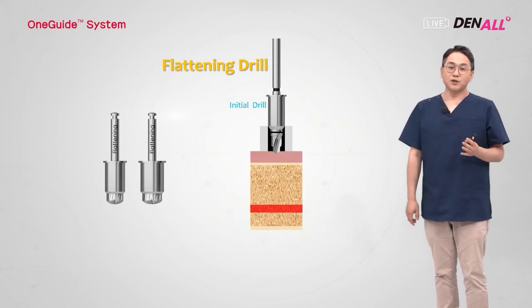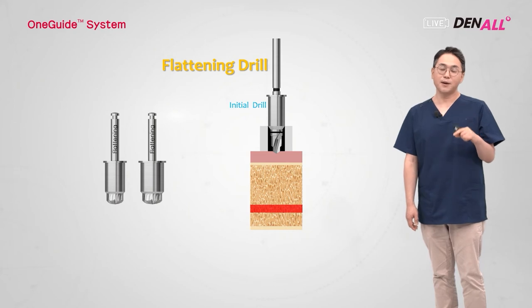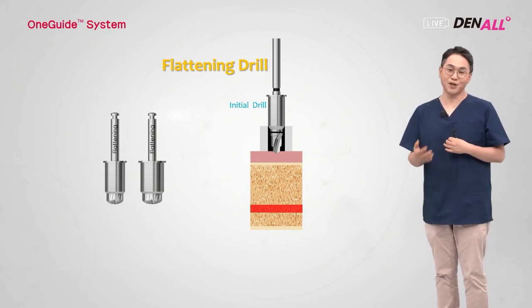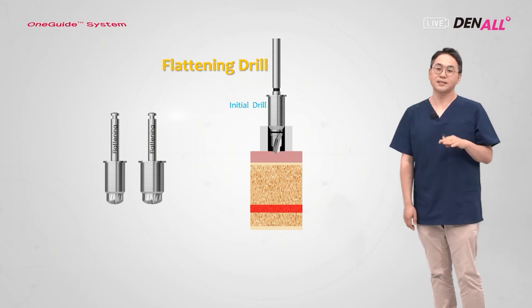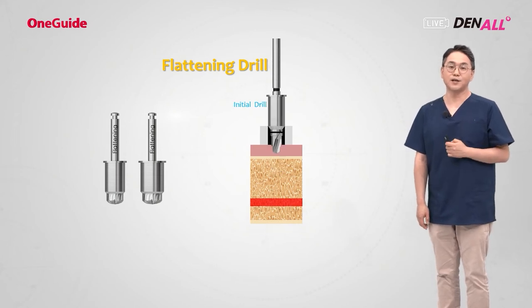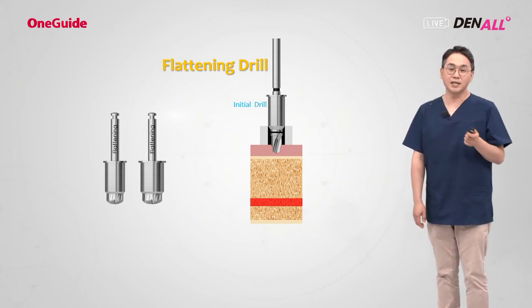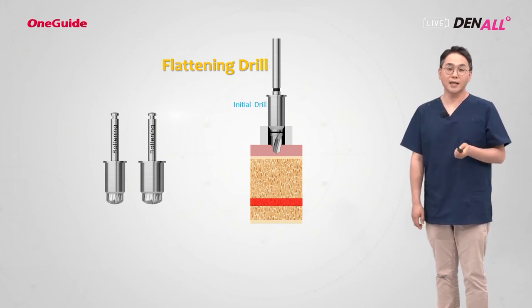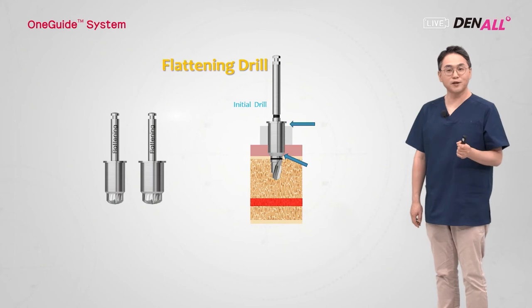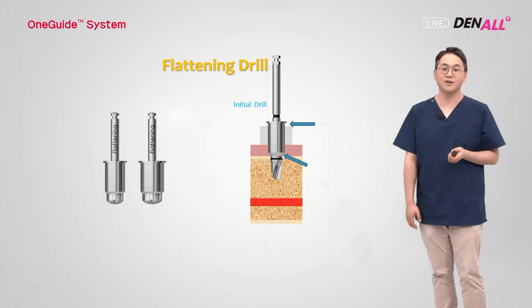For normal drilling, after opening a flap, the drill is driven until the stopper of the taper drill reaches the top of the crest. But in a guided surgery, drilling is done through the guide hole. Mostly in flapless surgery, we cannot see the inside, so mostly it is driven until the stopper of the drill reaches the top of the guide hole. But if you plan to place an implant deep, you can encounter this situation where the stopper of the initial drill cannot reach the top of the guide hole. In that case, you can be frustrated. Even with sufficient pressure applied, the stopper of the initial drill cannot reach the top of the guide hole.